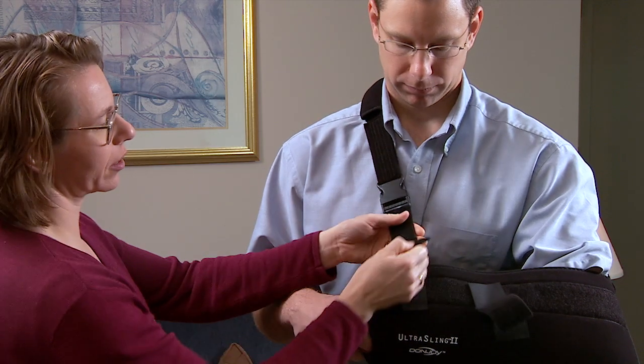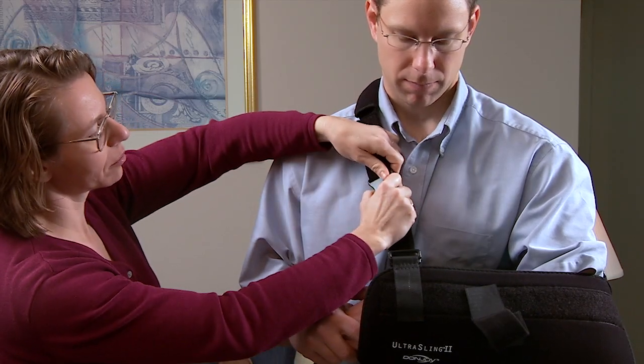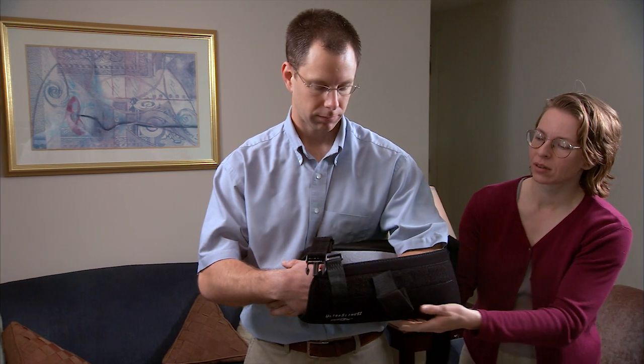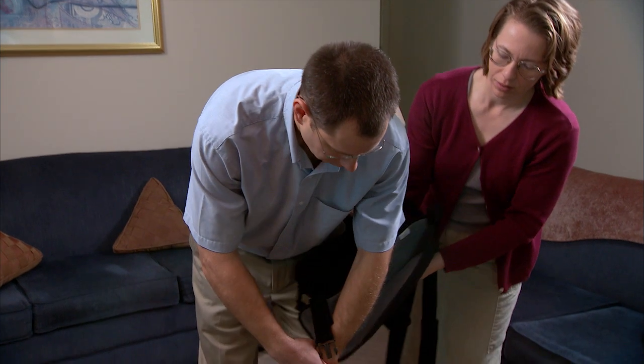Your helper releases the Velcro on the shoulder strap to loosen it, then unbuckles the strap. Keep holding your arm so it doesn't drop. Bend forward slowly, still holding the hand of your healing arm. Straighten your healing arm at the elbow and let it dangle. Your helper then removes the sling.